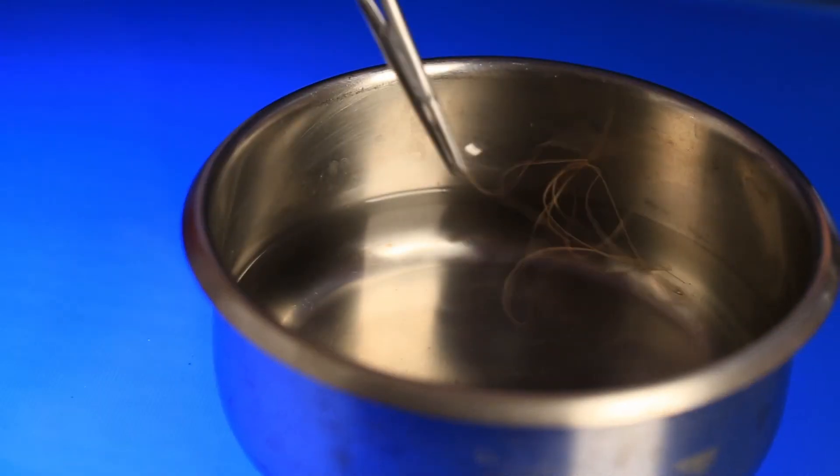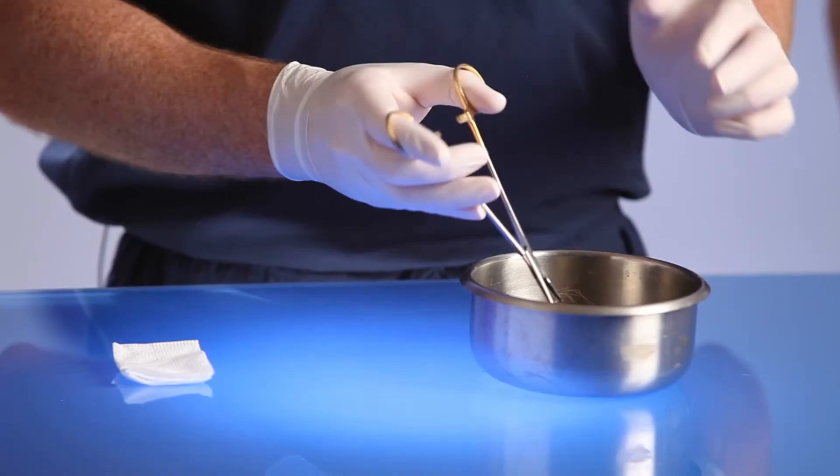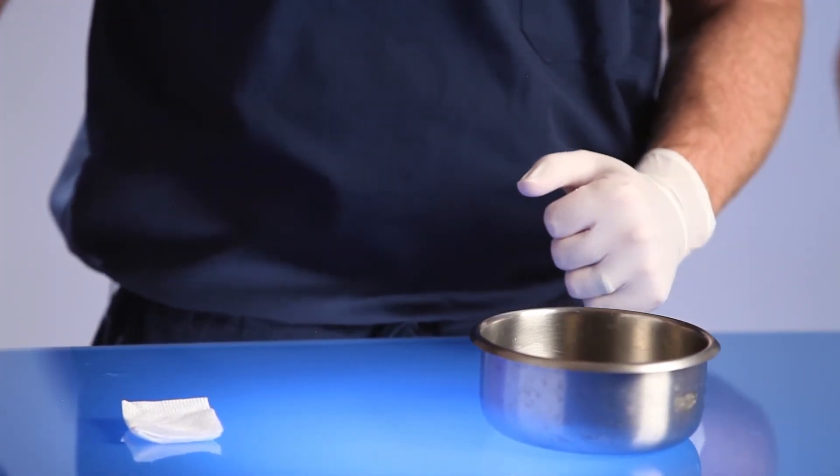You'll find that gut and chromic gut sutures get very sticky after they dry out or touch blood. Chromic gut sutures are packaged in an alcohol preservative. To keep the suture soft, you can leave it in a bowl of saline after opening it.